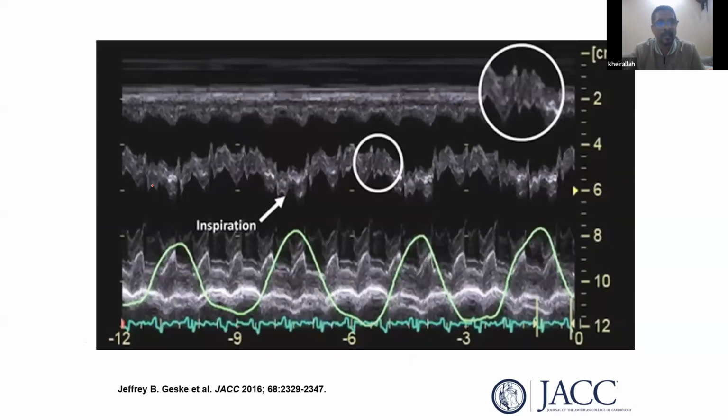And this partially explains it. Look at the septum in constriction. This is the interventricular septum. This part of the spirometer is inspiration. During inspiration, what happens to the septum? It goes toward the left side. So when it goes toward the left, the right side fills with blood, so the pressure is going to be high. Lacking space, what happens to the pressure on the left side? During inspiration, it's going to be low.